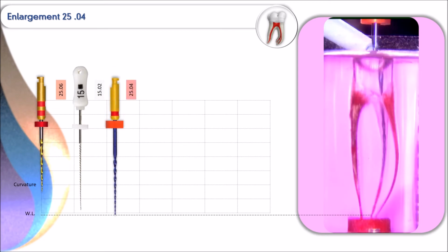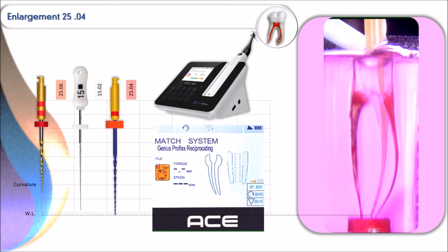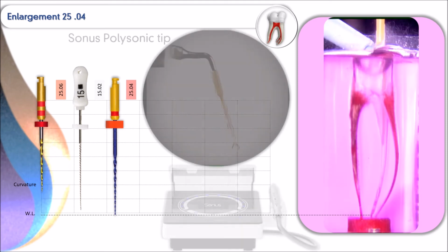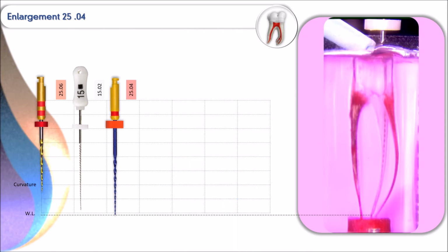This file can be used in rotation or even reciprocation with the Genius motor or the new ACE cordless endodontic motor. Do not force or use pecking movements. If resistance is encountered, pull back the instrument until you release it and proceed with brushing movements. Do not remain more than 10 seconds with the instrument active inside the canal. Copious irrigation and patency with the K-file 15 should always be performed after 10 seconds of file usage.